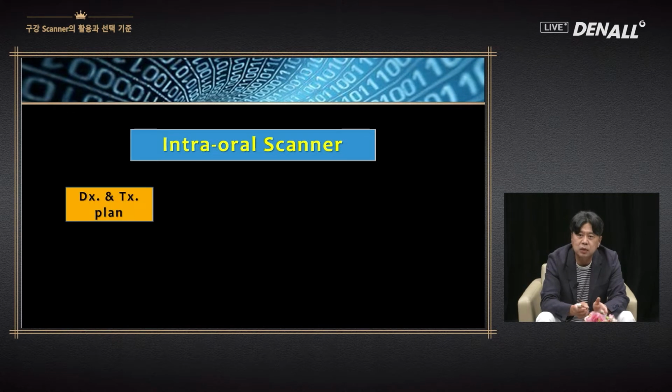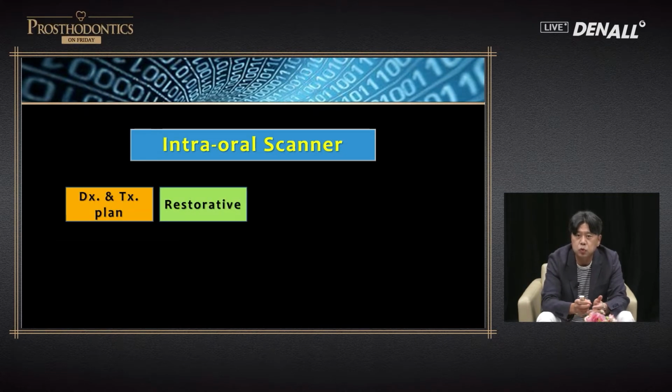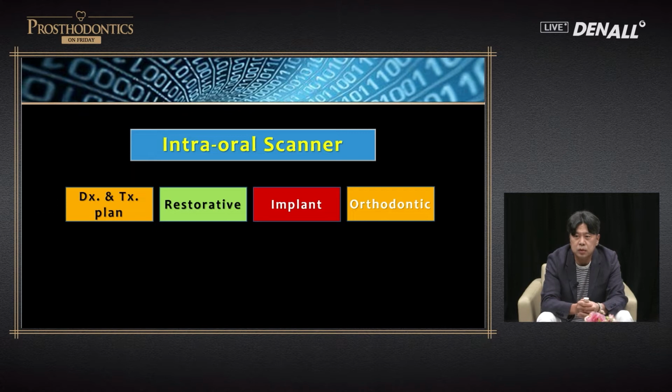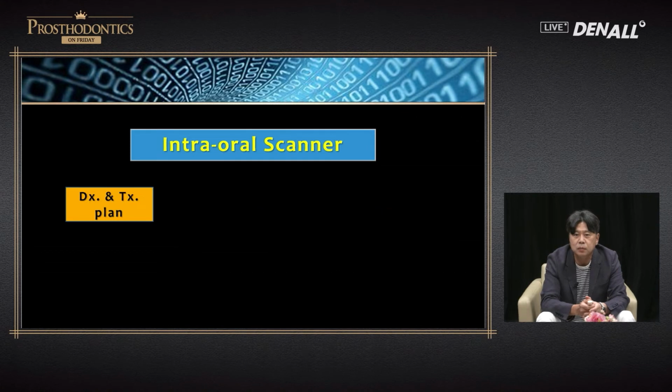In a local clinic, we do the workflow like this: diagnosis and treatment planning, restorative, and we do a lot of implant placement. And the ortho treatment is delivered by many dentists. These four items are the treatment areas by local clinics, and most of them can be started with the intraoral scanner or utilize the intraoral scanner. Let's have a look at one by one.